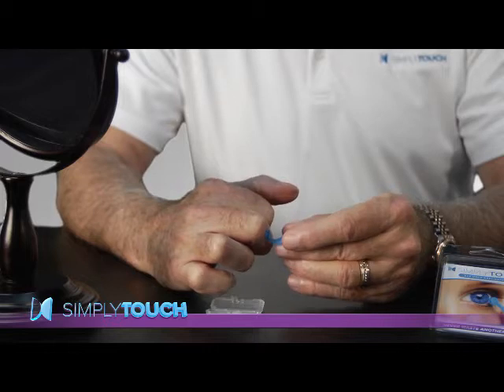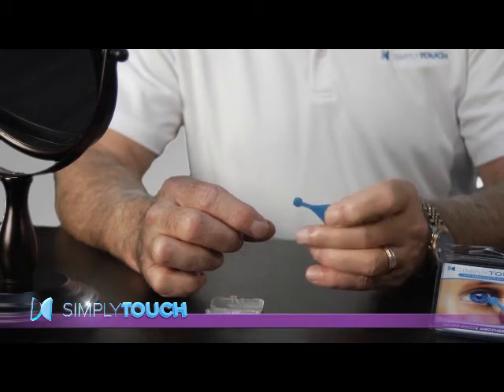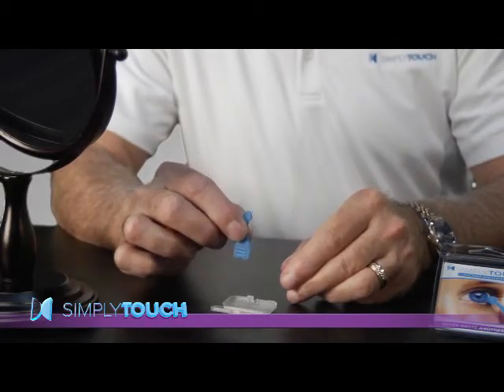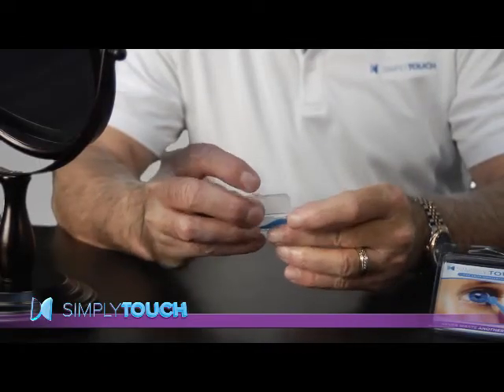Hello, I'm Doug Mansfield, the design engineer for Simply Touch. Simply Touch is made from a high-energy elastomer that is soft, flexible, and reusable. The applicator has a grip end and an eyedrop end and has two sides, one for prescription and one for over-the-counter drops. It has its own custom storage and carry case.